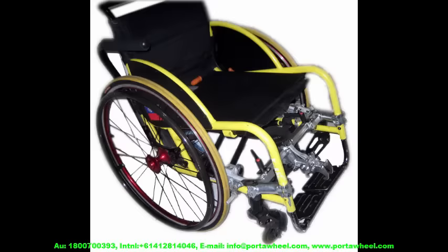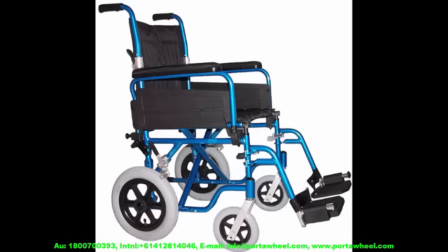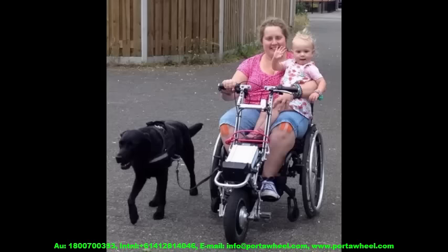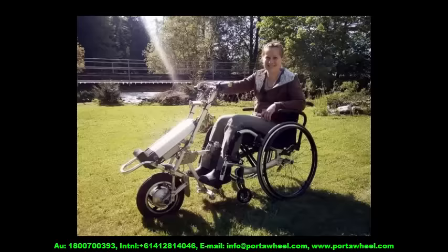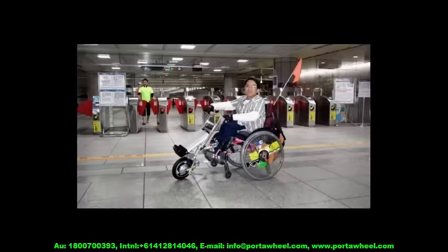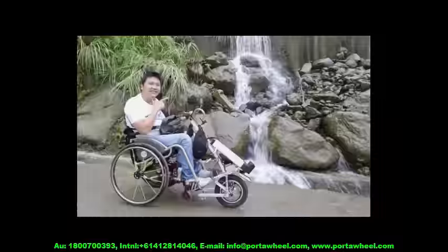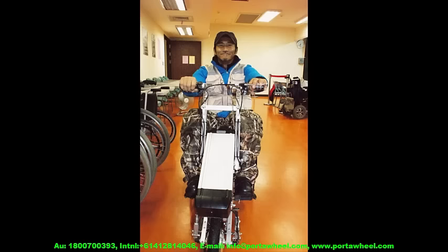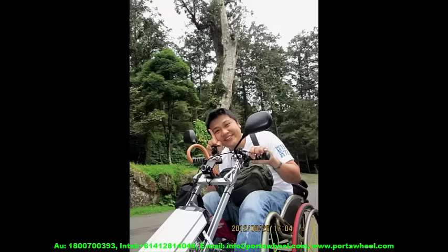If you're in a wheelchair — manual or electric — or even if you're just struggling to walk lately and you're looking at getting a wheelchair or a mobility scooter, please watch how the amazing PortaWheel wheelchair Power Assist will smash your mobility barriers, just as it has done for hundreds of mobility impaired individuals around the globe.